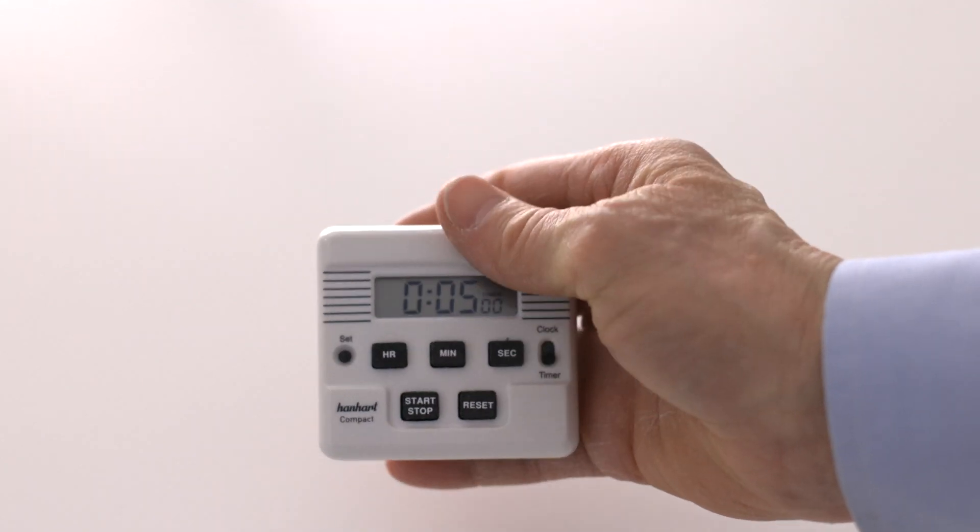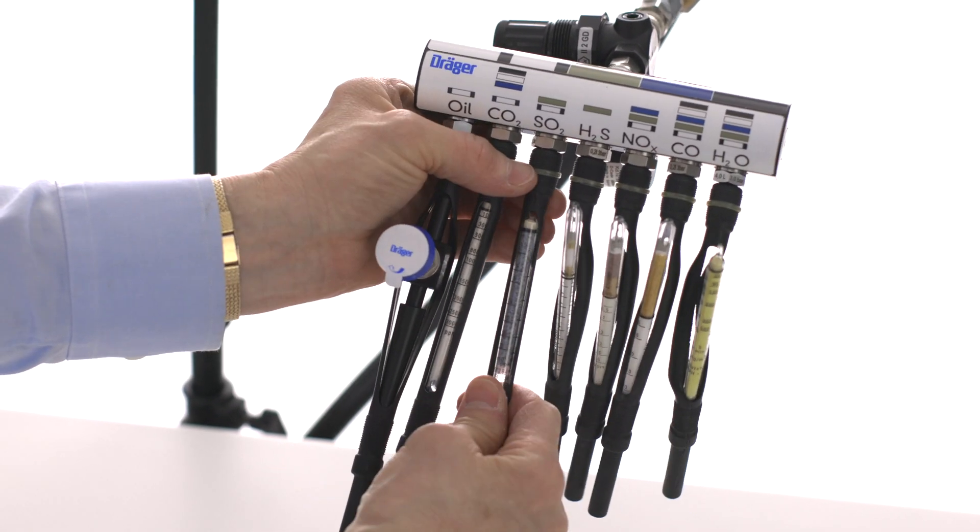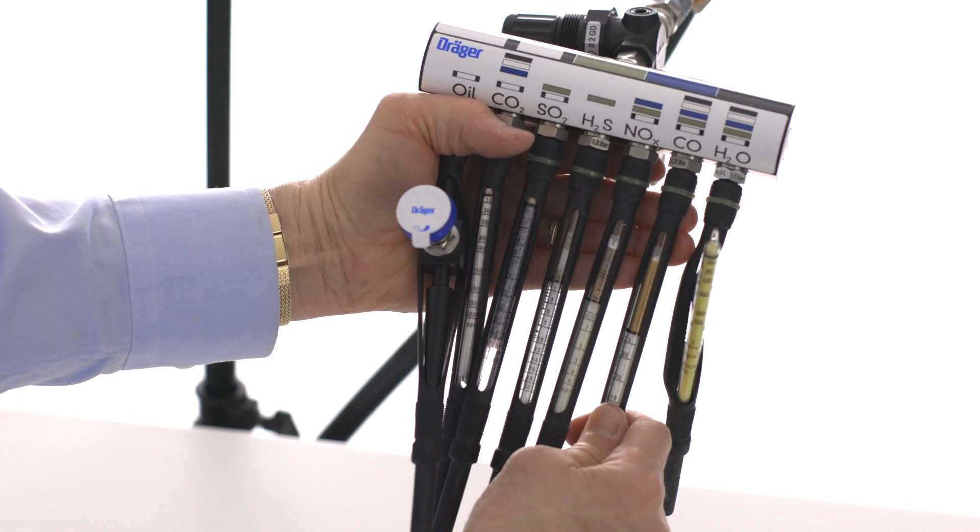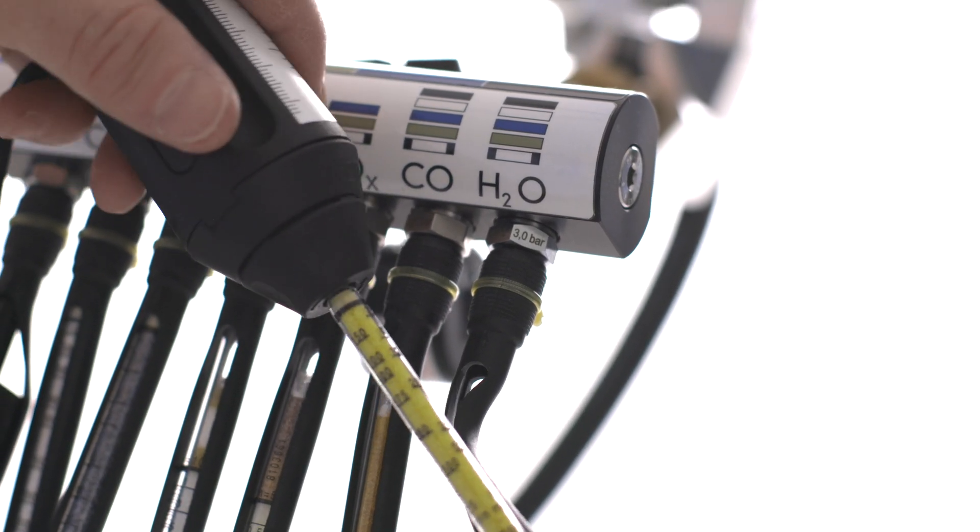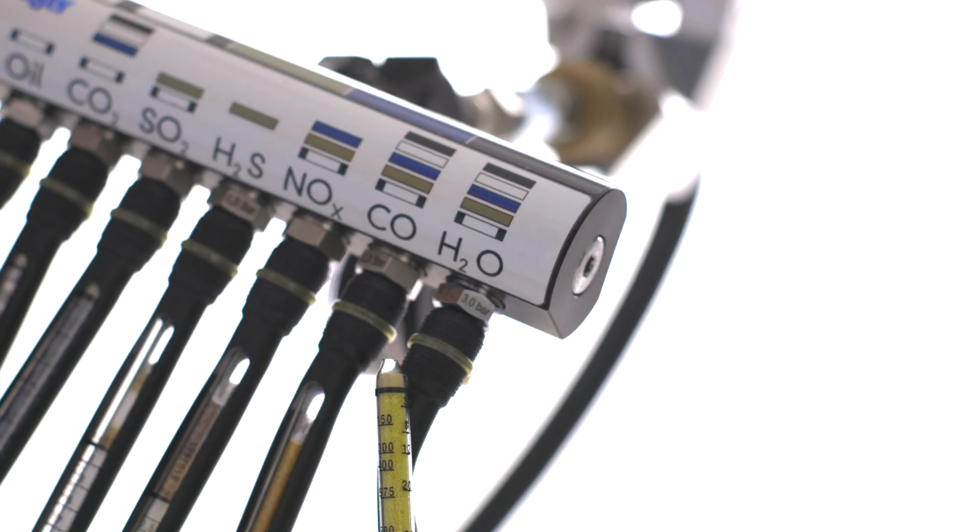Start a 5-minute timer and immediately connect the oil impactor and the tubes, except the water vapor, to the inlet of the holder, then use the tube opener to remove the tip from the water vapor tube and connect to the inlet of the holder.